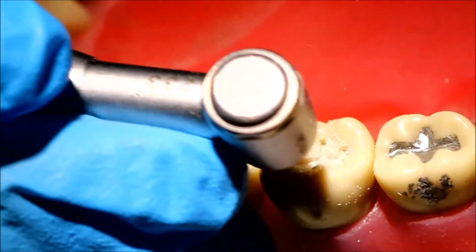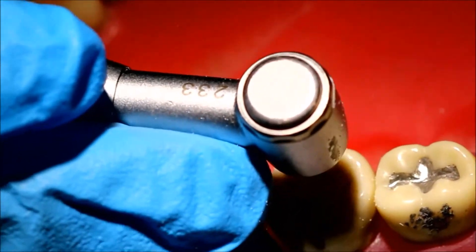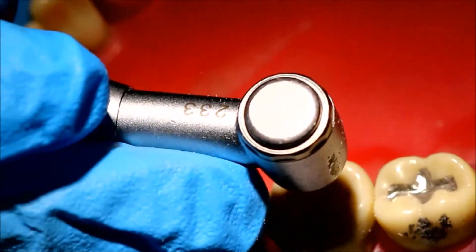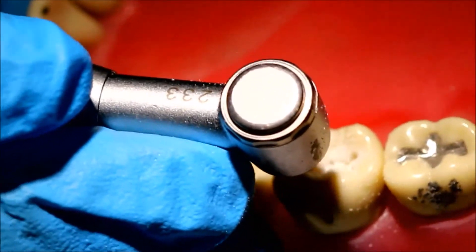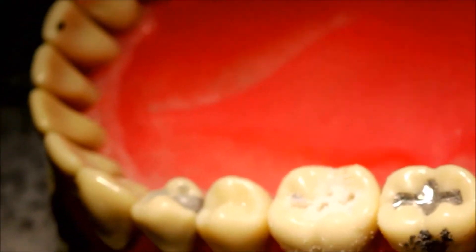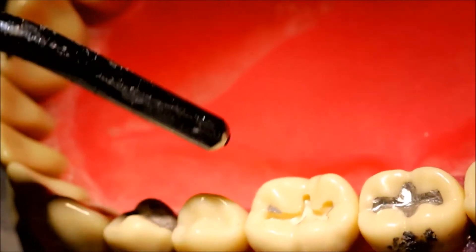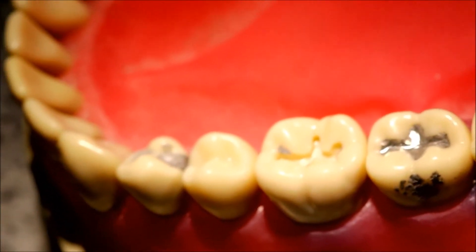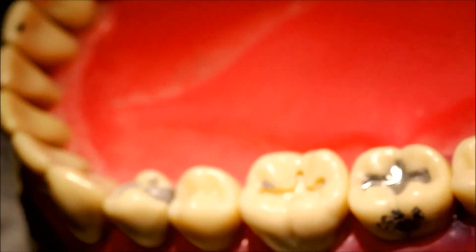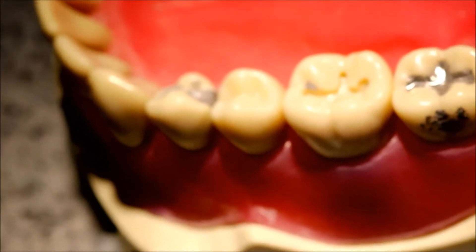I'm now using the 34 burr in my low-speed handpiece. The 34 is a really short, flat burr, so you're going to concentrate only on the pulpal floor. I'm pressing down as opposed to against the vertical walls. This will also give a little bit of extra depth, because the 329 has a depth of 1.2 millimeters but our target is 1.5 to 1.9 millimeters.